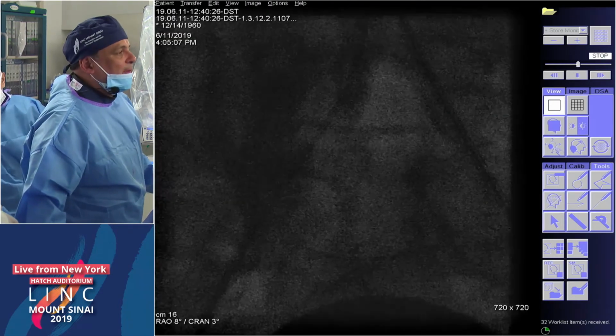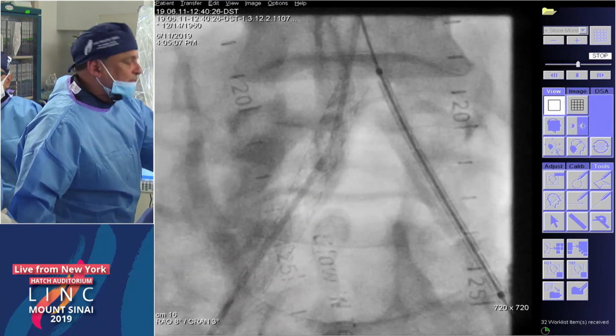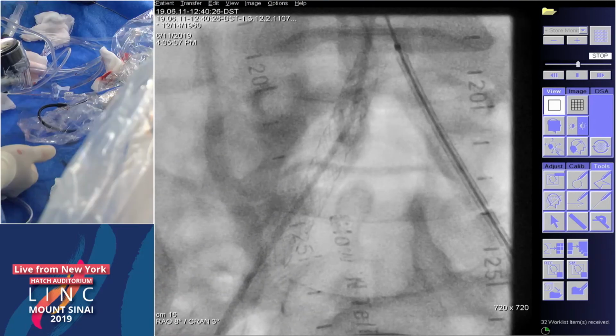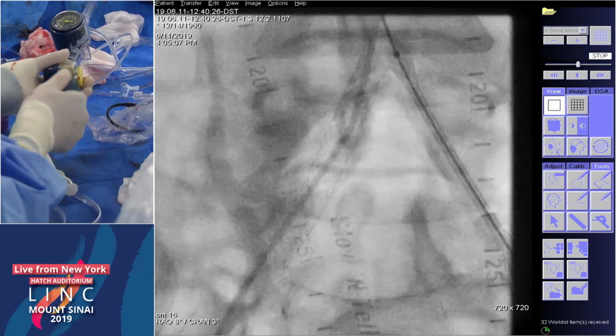Let's go up. Okay, going up. You can even cheat up a tiny bit if you'd like. I think it's going to shorten. I like it right where it is. He's right at the same level as the other stent. Ready? Yeah, go up. Yeah, I agree. Yep, I like it too. Right there. There you go.